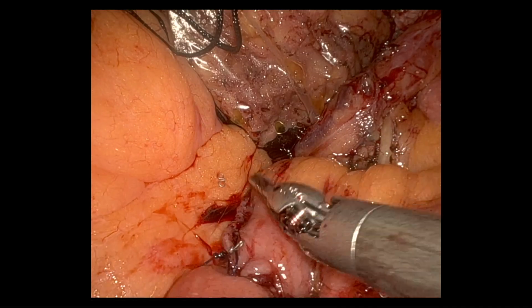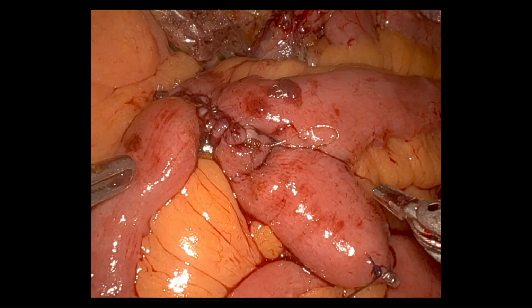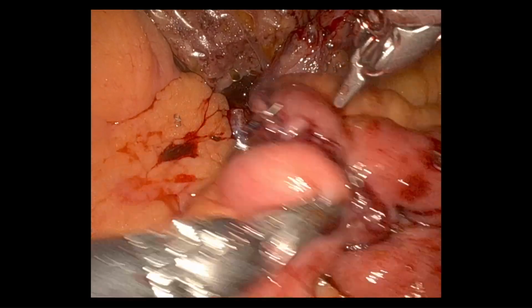Once this is done, we proceed with the next step of the cystectomy, that is the ureteroileal anastomosis.